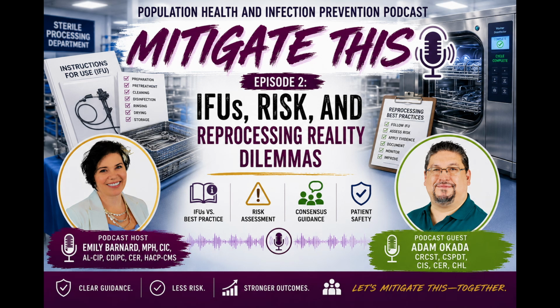I'm thinking of one example where an FDA approved product had been used exactly as intended, but under certain manufacturing pressures, there were no validated reprocessing instructions available. After some digging, I found an internal memo indicating sterilization was required, yet there had been no compliance testing on how sterilization would impact the device metallurgy. That ultimately led to a product recall and emergency efforts by reference labs to develop safe reprocessing guidance, all while healthcare facilities were left scrambling and patient care capacity was impacted.